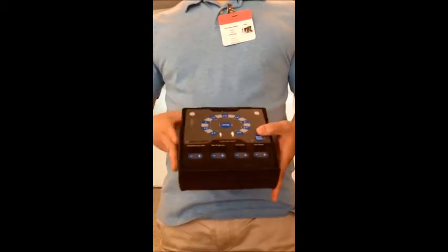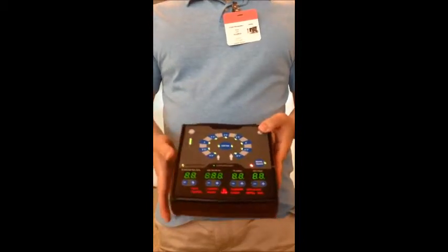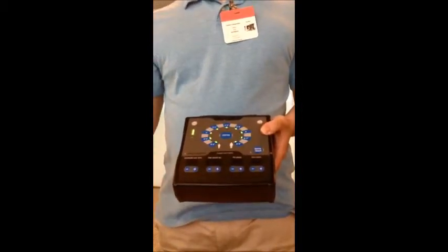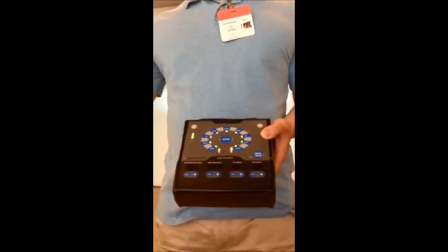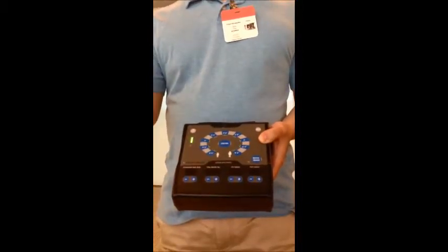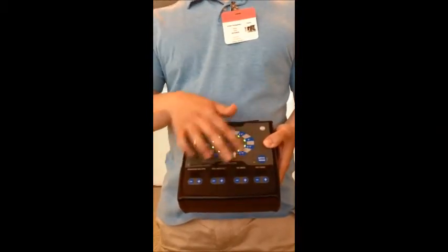So I'm going to do a quick run through of what the device is capable of doing for a particular patient. When you first turn the device on, you'll see a dashboard of lights down here. Those are all the alarms that can come up. They're purposely blanked out so that normally it's not distracting someone, and especially someone minimally trained, they're not going to be distracted by all these other things going on. But if an alarm does happen to come up, only that alarm will show up to tell them specifically what they need to look at to solve the problem. So right now the unit is prompting the user to select the patient's height.